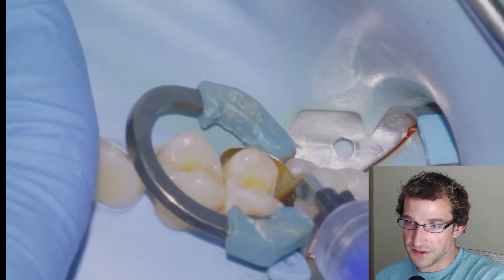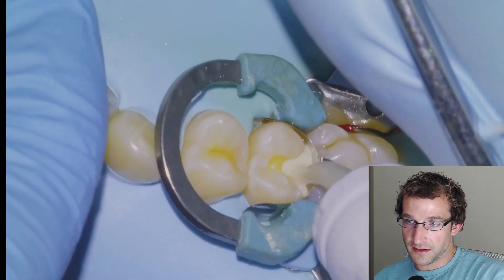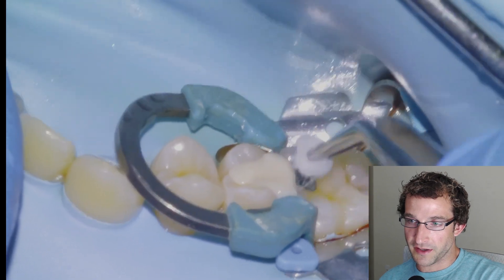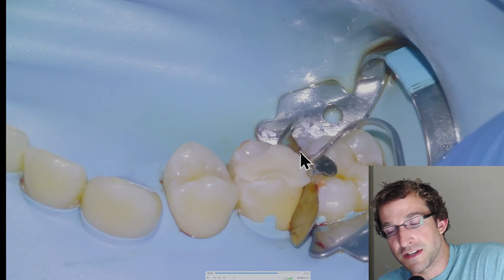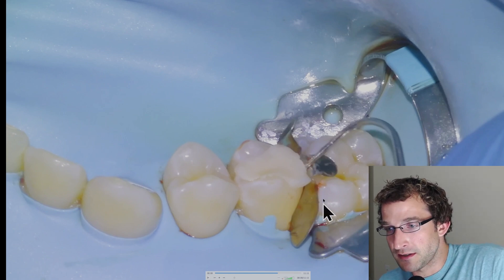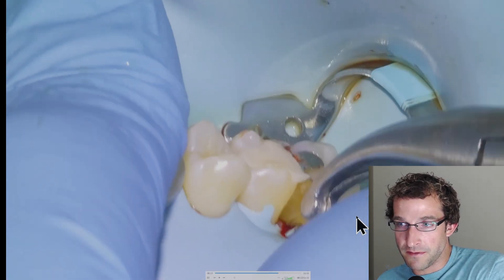I like to use Equia Forte. I'm going to etch for five seconds, rinse, dry, apply the material, pack it in with a moist cotton pellet, and leave it for about five minutes. Then we'll come back, remove the sectional assembly, and take an explorer to get the wings out from the restorative material so we can remove the band with how pliers without damaging it.